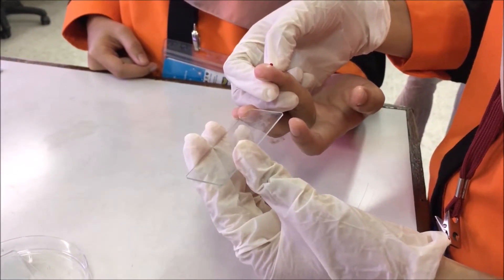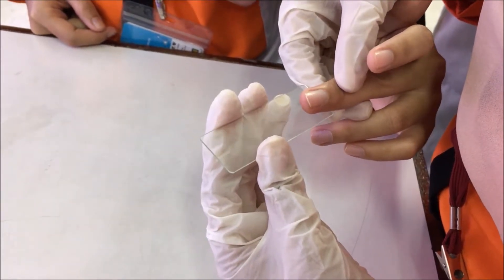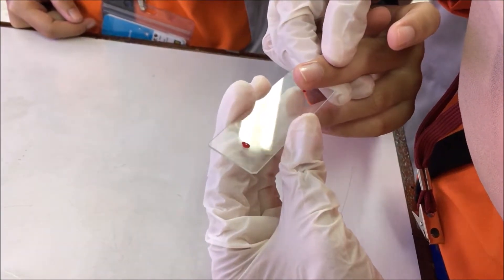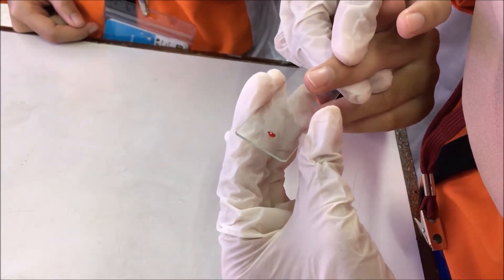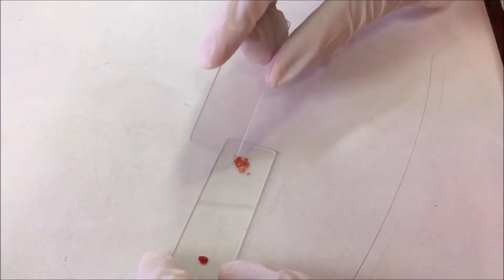Simply drip a single drop of blood for thin film and several drops on the other end for thick film. Using the tip of the spreader, join drops of blood to make thick film.